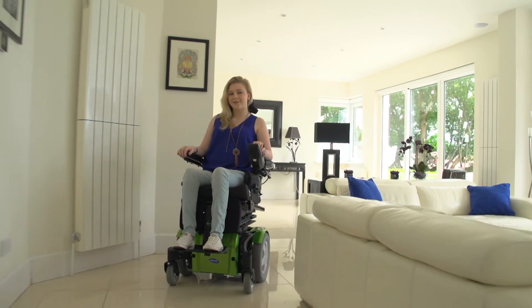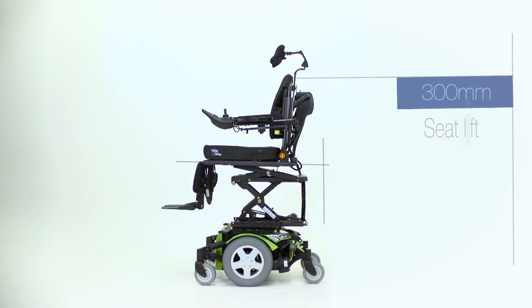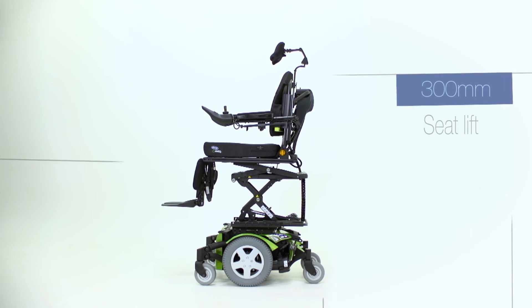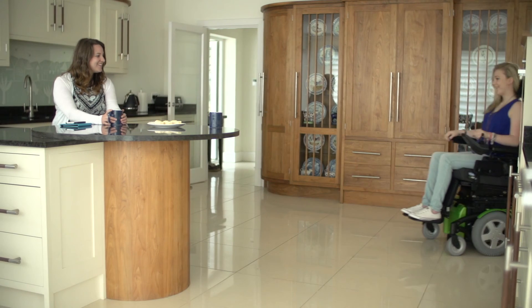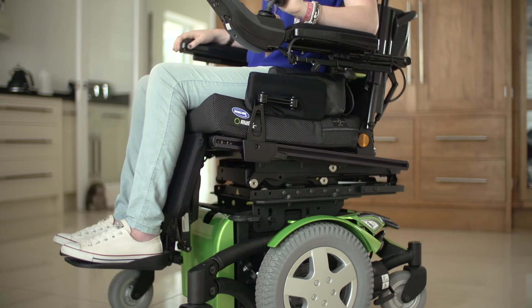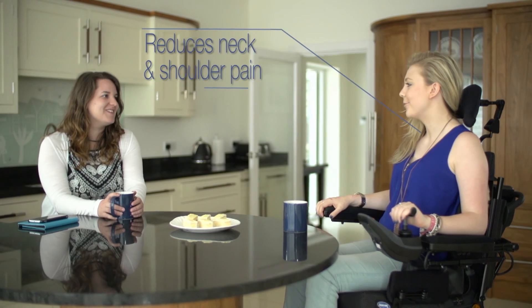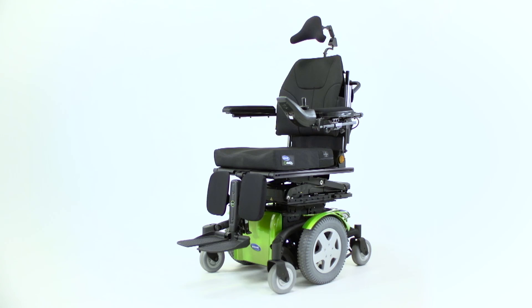This allows individuals to reach further and more fully interact with their environment. Being able to raise the seat up to 300mm allows individuals to more easily participate in eye-level communication. In addition, speech, swallowing and breathing all become more efficient due to the more natural position of the head and neck.